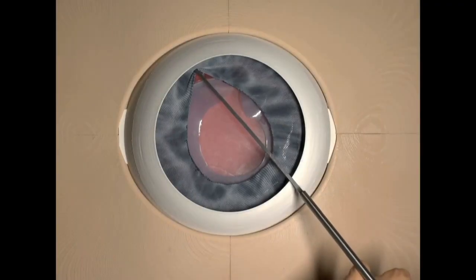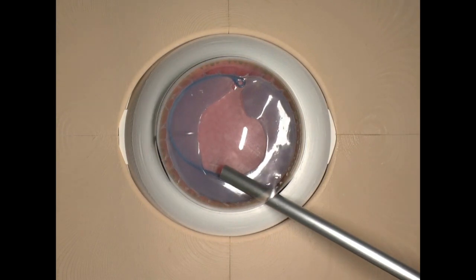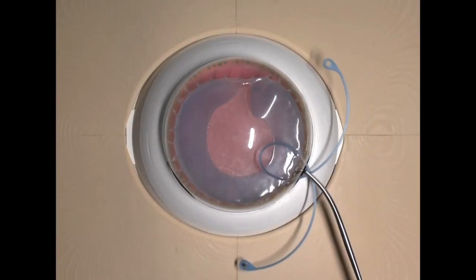If a zonular damage occurs with capsular defect, we risk leading the ring out of the capsule using the traditional technique for ring implantation. There are several techniques to prevent this and to lessen the strain on the remaining zonules as well.